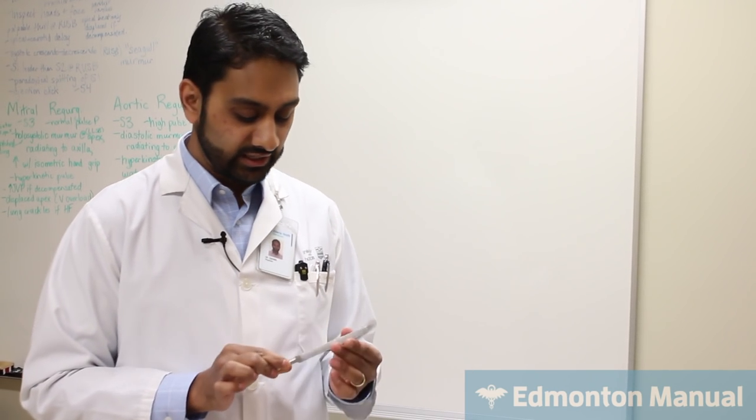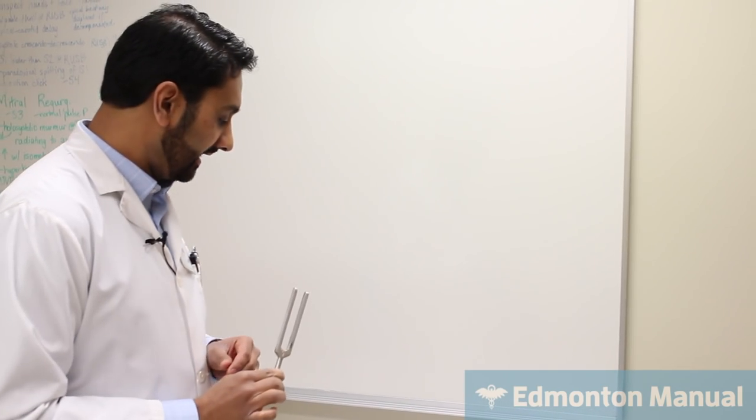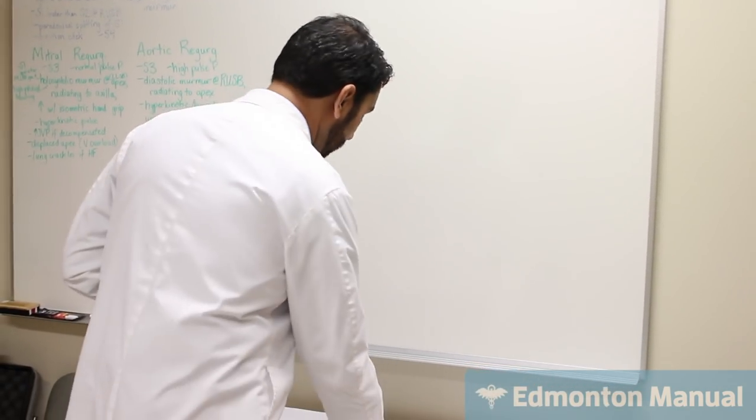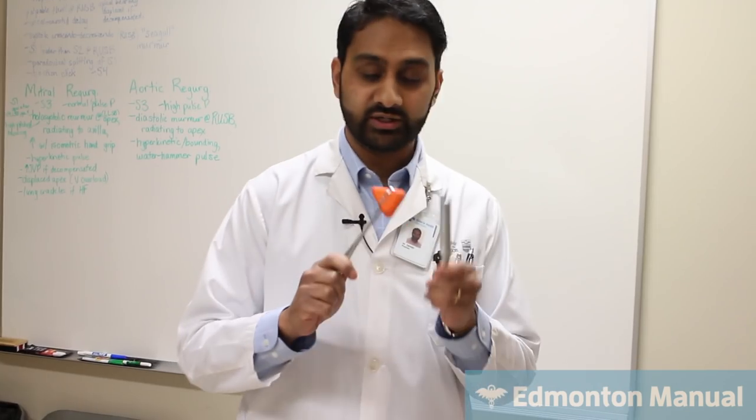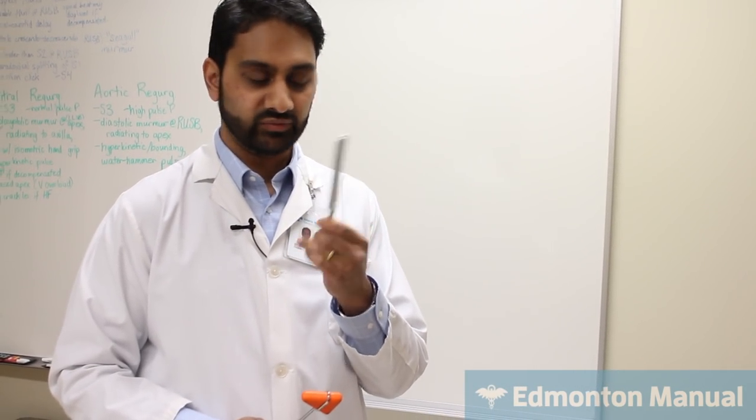So we're going to start with the 512 hertz. This is the tool you use when you're testing cranial nerve 8, specifically the Weber and Rinne tests. With this tuning fork, you're going to strike it. Whenever you strike a tuning fork, what you will commonly see people do is hit their elbow. I don't know why they do that. That hurts. I would honestly suggest hitting some other surface, or if you have the reflex hammer, you can just hit it. And that rings very nicely.